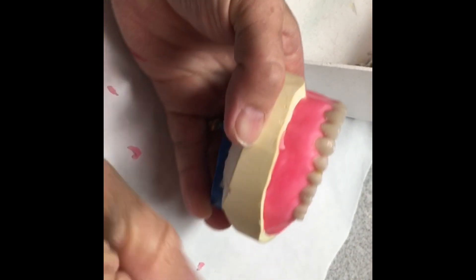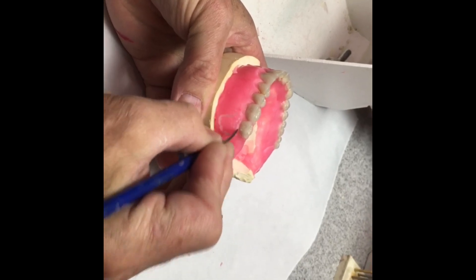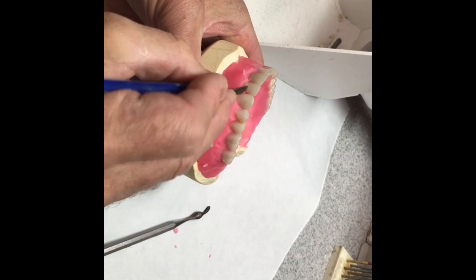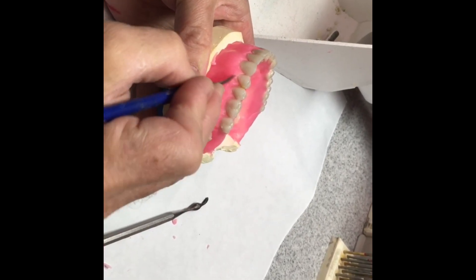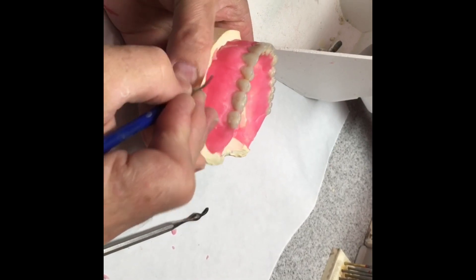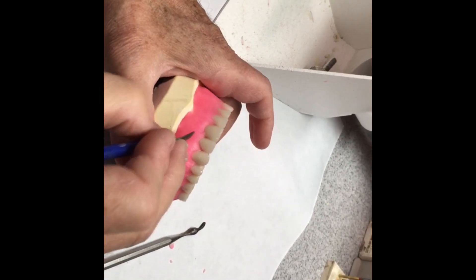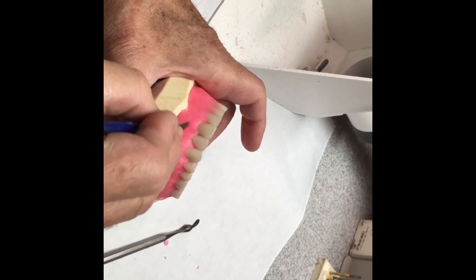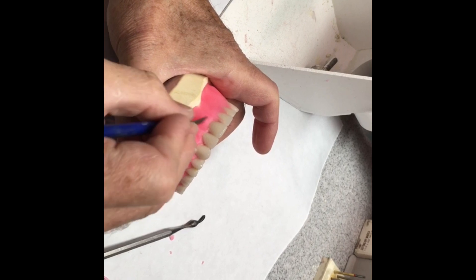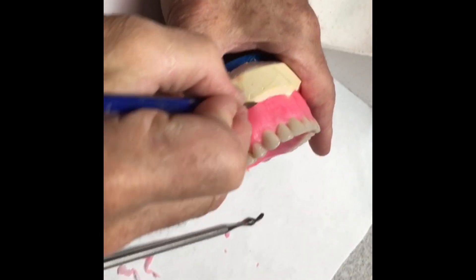Now we need to remove some of this shelf. Take a number seven wax spatula and take this down to where we want to leave at least a millimeter of that shelf. We don't want to make it so thin that the root portion of the denture teeth shows through. If we want to make some root prominences, I'm going to reduce a little between the teeth. I'll have a good-sized root above the central and a very short root above the lateral, to break up the difference between the two. We don't want them all the same size — like stovepipes — coming out of each tooth.